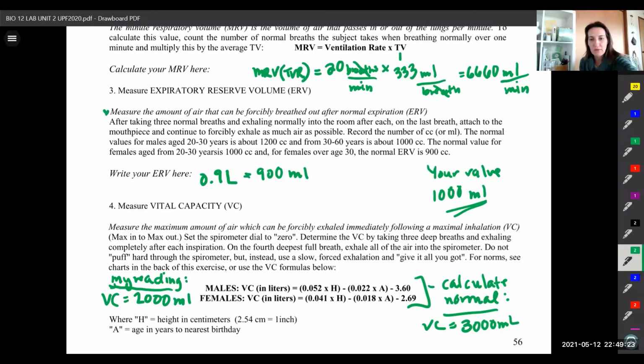Quick note here about age. Now, it makes sense that we might take into account sex here, because generally there is a difference in terms of lung volumes for males and females. Height makes sense as well due to body size. There's going to be a difference in lung capacity. Age is interesting to think about. We can ask, well, why do you consider age here?